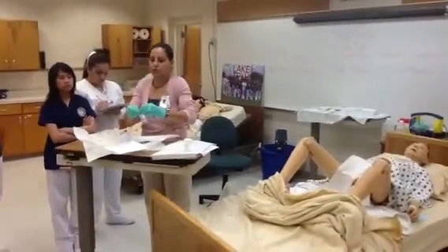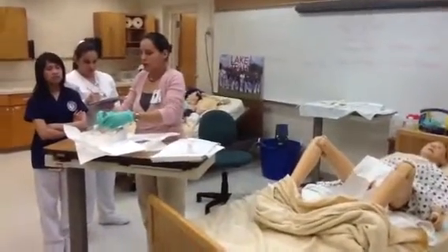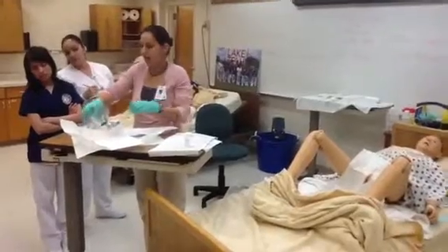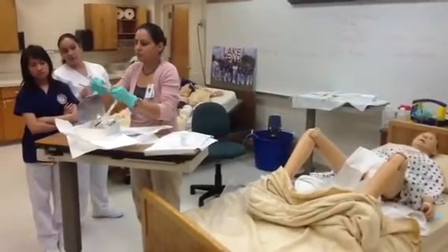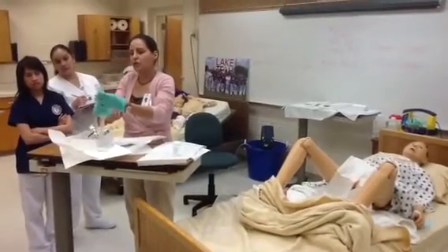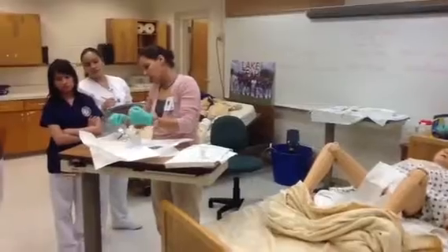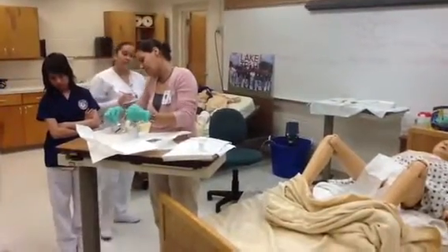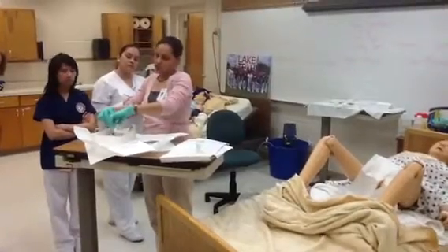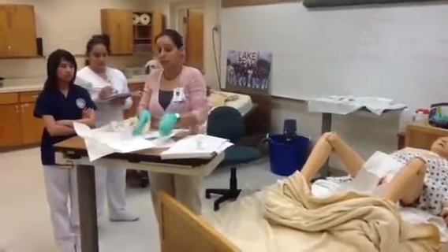The next thing I'm going to do is tear open my lubricant and attach the little lubricant packet to my alligator clip. And I never want to touch the tip of my catheter, so I've exposed the tip of my catheter, and I'm going to go ahead and get it into my lubricant, and it'll maintain protection in the sheath and in the lube.